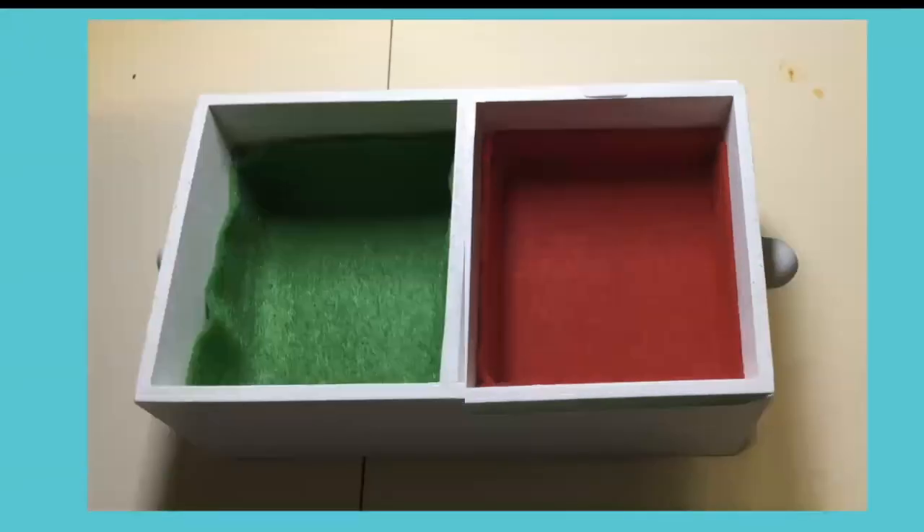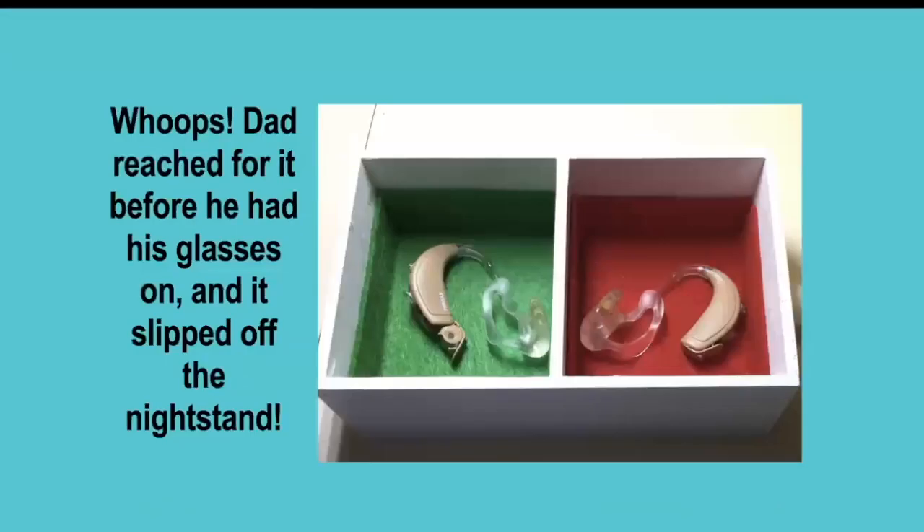Then put the green in the left-hand side. So here we have it — I thought it was great. But the next day, dad reached for it before he got out of bed, before he had his glasses on, bumped his hand into it, and it slipped off the nightstand. The hearing aids went onto the ground and I still had to crawl around to find them. So we had another problem to solve.